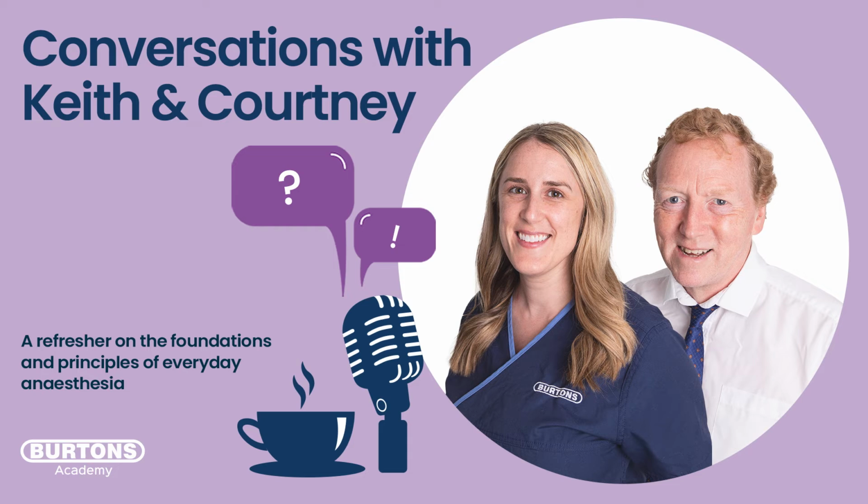It points us to there's a problem, and then we can identify where that problem is, and then we can deal with it. So we've understood why the number's important, and now we're understanding that actually the waveform is just as important. The waveform is highly important, yes. And there's a certain amount of information in the numbers. Obviously there is, and as we explained, it reflects the adequacy of ventilation overall for the patient.